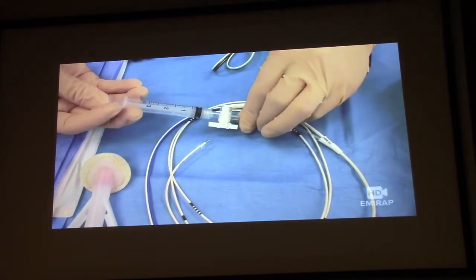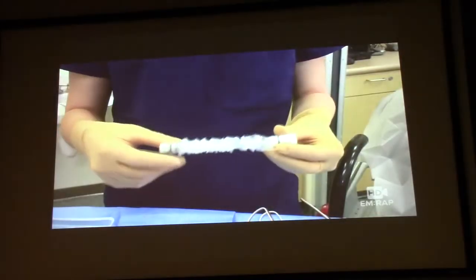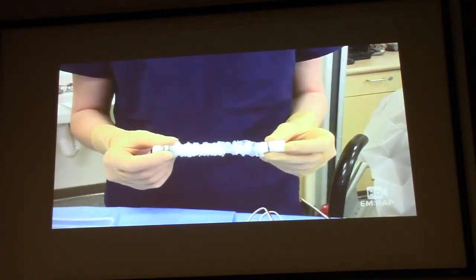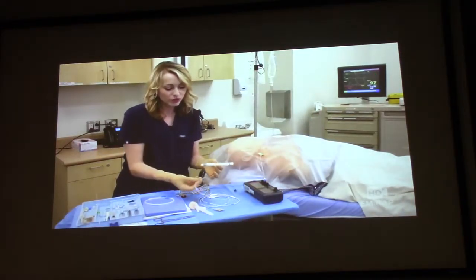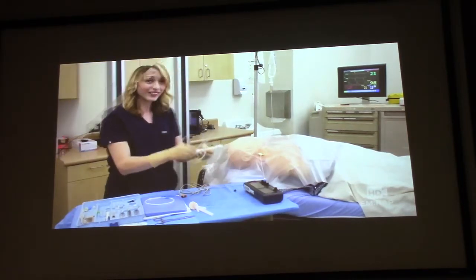And then you're going to deflate the balloon, keep the stopcock open, and now we're going to use our sterile sleeve. So the sterile sleeve direction really matters. This side is going to connect to the cordis, which means that the wire has to feed through it this way. So we're going to feed the wire through the sterile sleeve. And now we're ready to put this wire in.